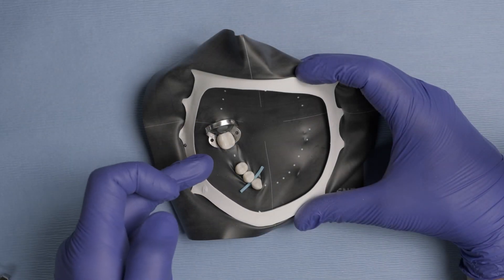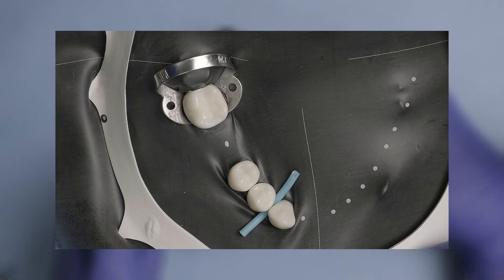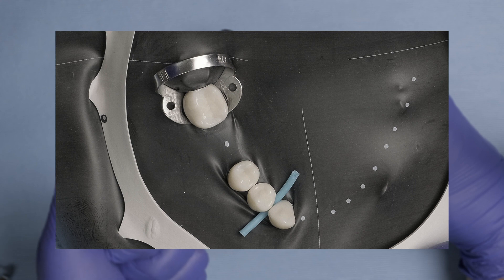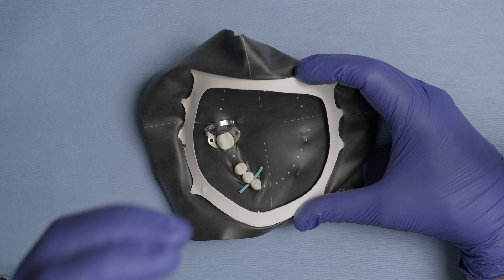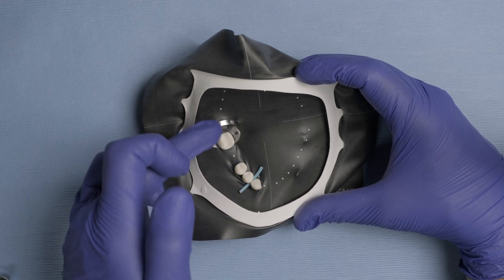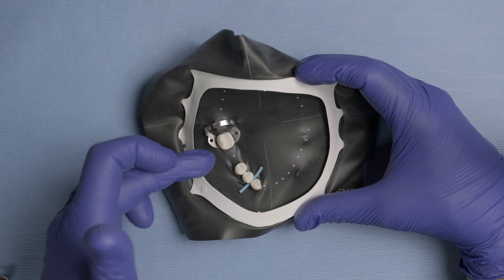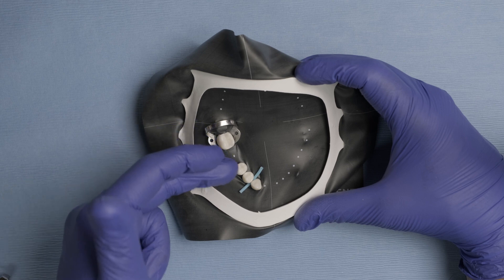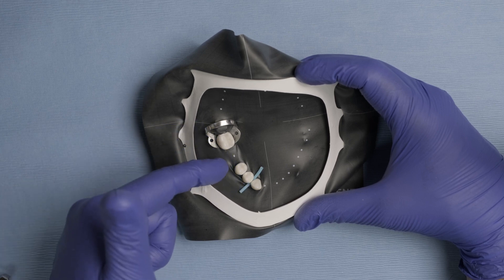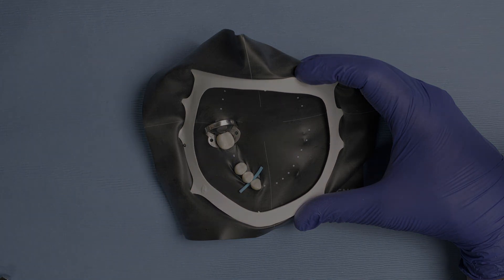We have completed our isolation in a really good way, meaning there is no tissue exposed. We don't see any pink tissue through our rubber dam, which also means no saliva contamination, no saliva coming underneath the rubber dam, no blood coming underneath the rubber dam — no contamination of our operative field, which is crucial during operative procedures. Keep in mind how easy this was, just because we have a pre-printed pattern. We know exactly where to perforate and where not to perforate to accommodate for any missing teeth in the arch.